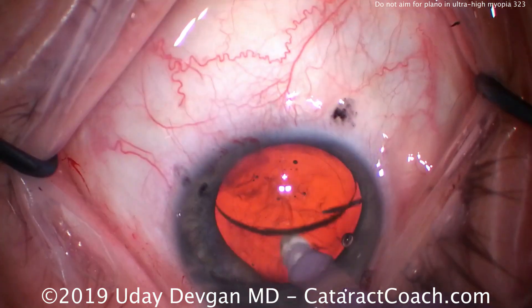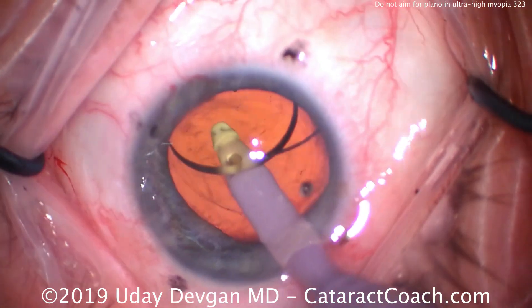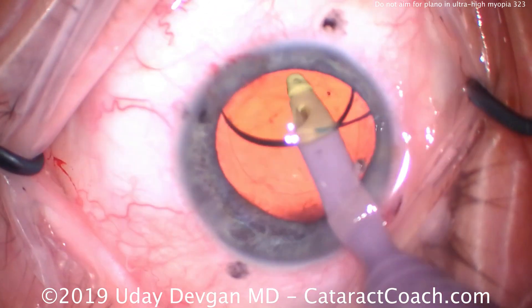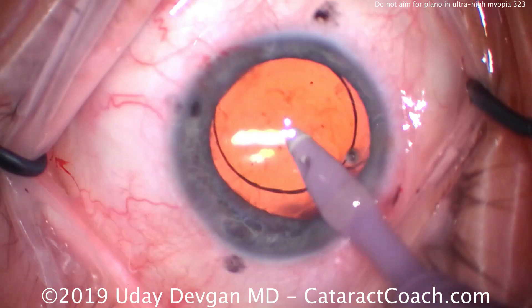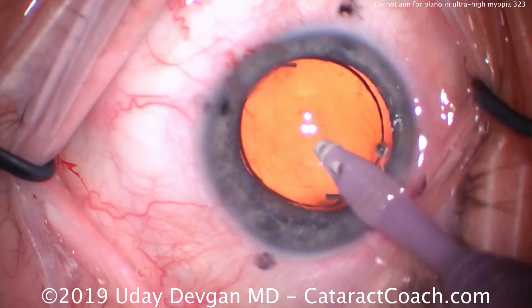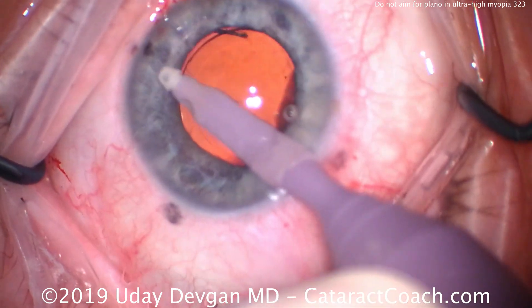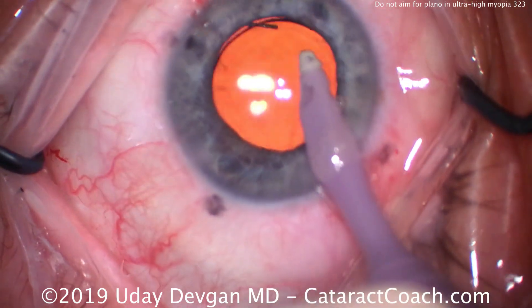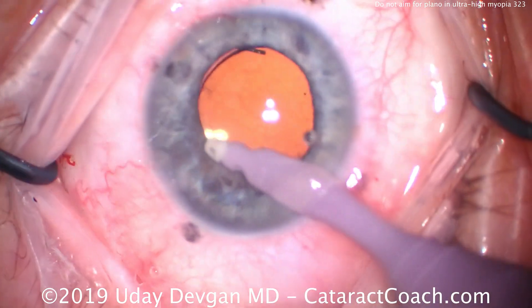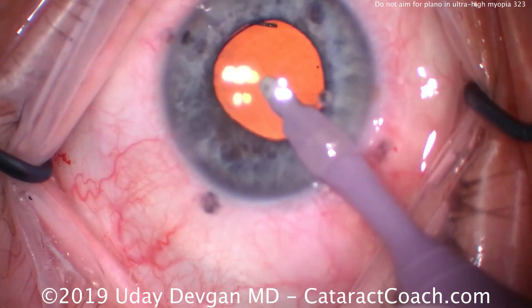In this patient, we did achieve our desired goal. The patient ended up about minus 5.5 diopters spherical after about a month of healing, and found that very useful for all the prolonged near work done on tablets and cell phones. Keep in mind, the patient is functionally monocular, so there are no worries about binocular vision at such a close range with the moderate degree of myopia left over.